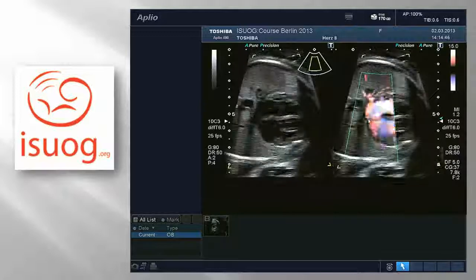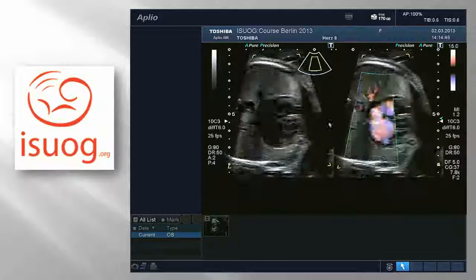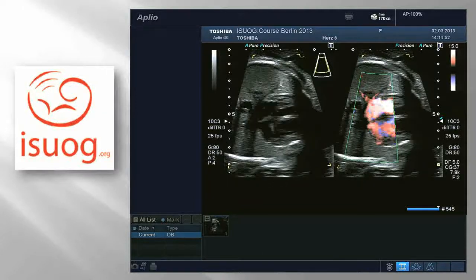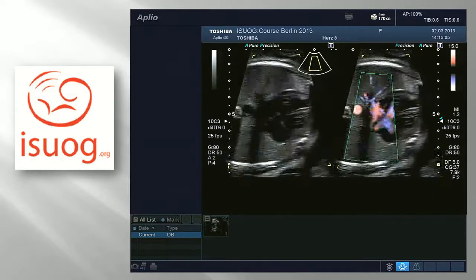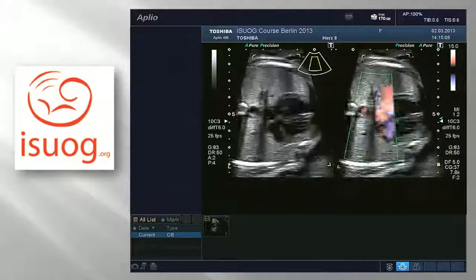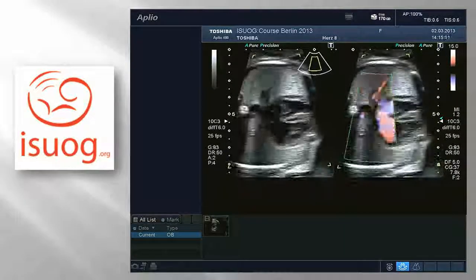And for the pulmonary veins in particular, I like to have this split image that I showed to you. You can have veins coming towards the left atrium here, but actually if you have anomalous venous drainage, they come towards here and then they disappear somewhere else. So if you have a twin image, you can see that actually those veins are really coming into the atrium, the normal communication. So your descending aorta.